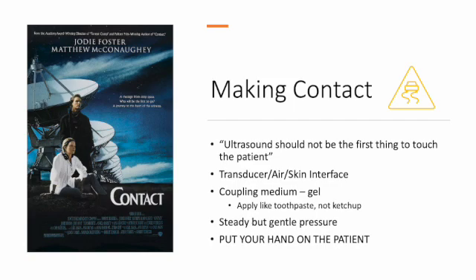And so I'm going to encourage you all to do physical exams first and then extend your physical exam by adding on the ultrasound. Contact in this sense is referring to the transducer air-skin interface. And that means that we've got this complex machine that's generating those mechanical vibrations that are causing sound waves, but we also have this gap between the transducer and the skin and the body. And so we need to overcome that in some way.